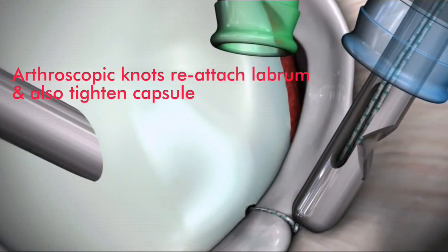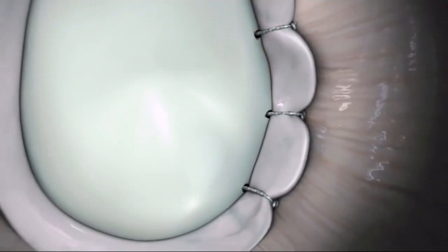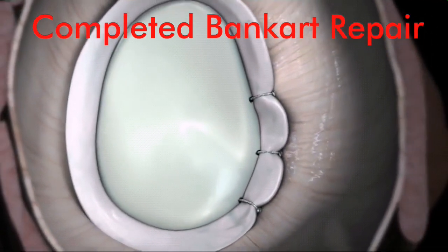Tie desired arthroscopic knots and cut excess suture. Repeat steps utilizing additional Y-knot anchors to complete the repair.